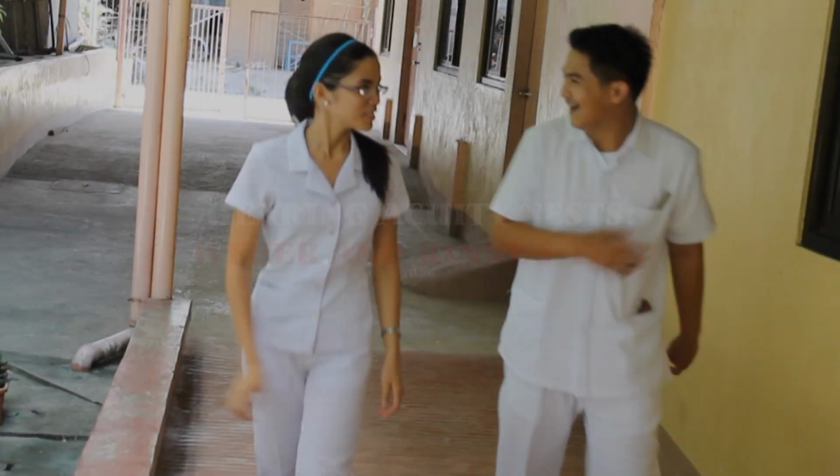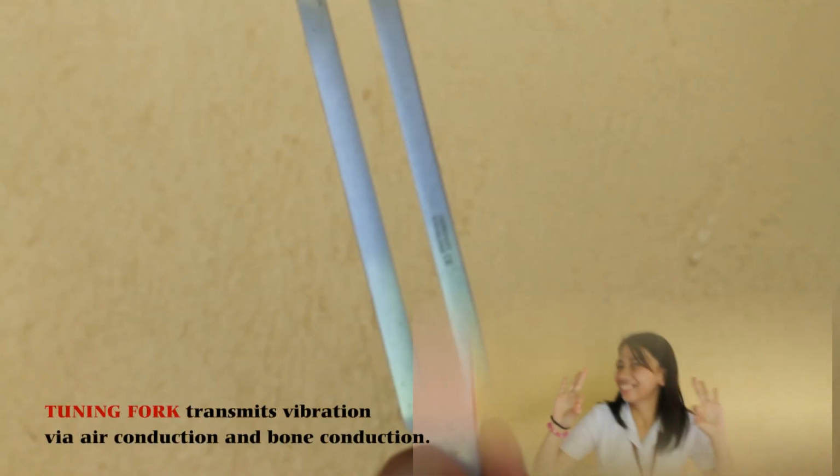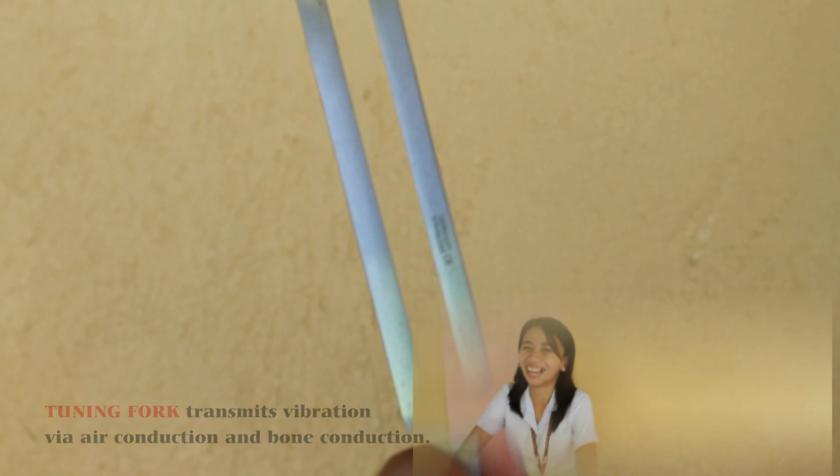Hearing acuity test. Test the patient's hearing using Weber's test and Rinne test. This is a tuning fork. It is used to evaluate bone conduction in Weber's test and used to compare air conduction of sound with bone conduction of sound in Rinne test.